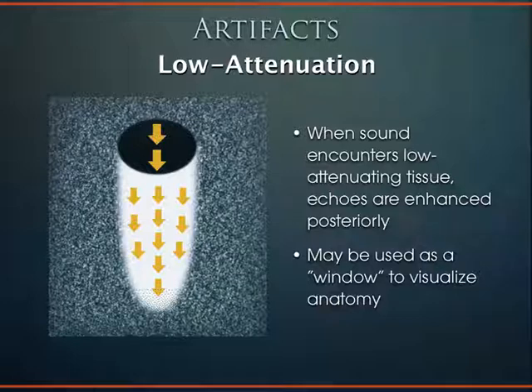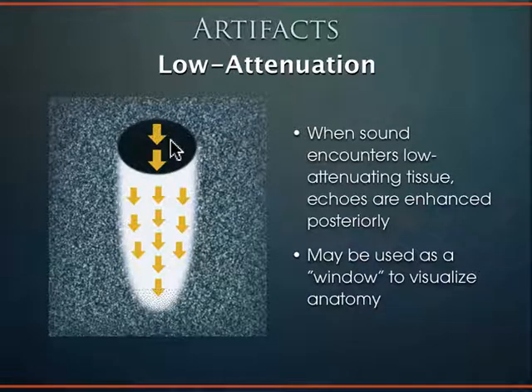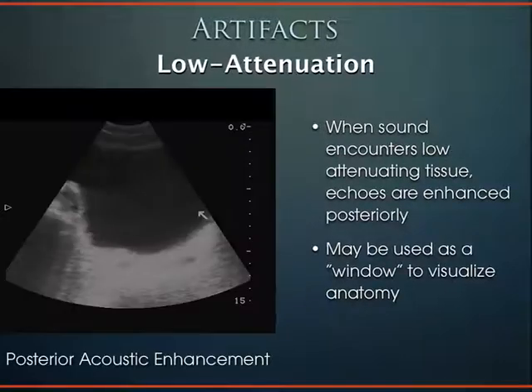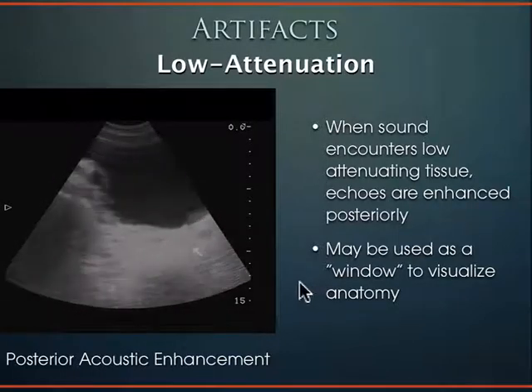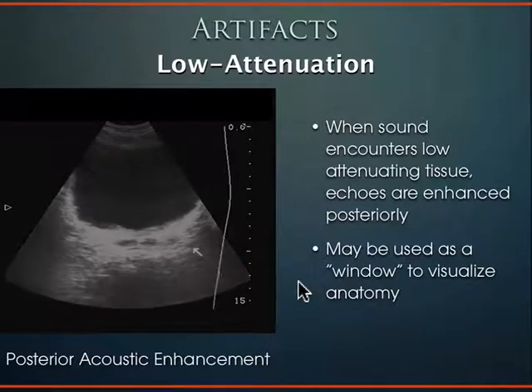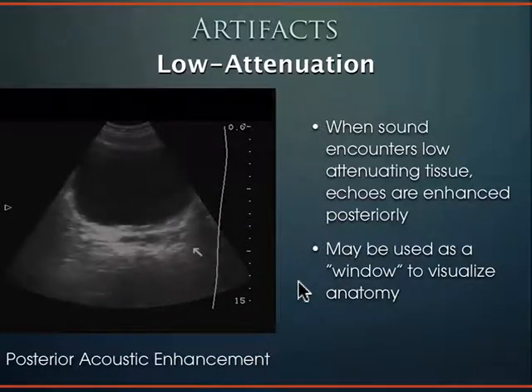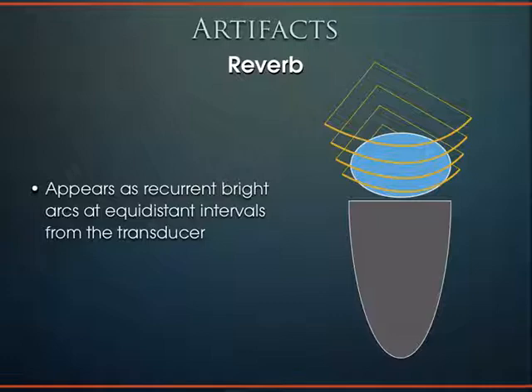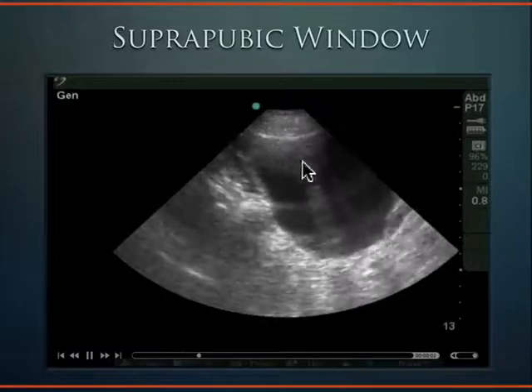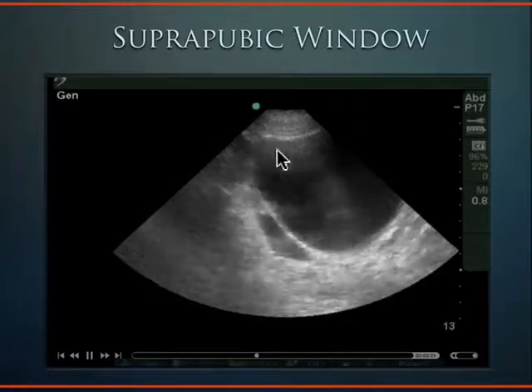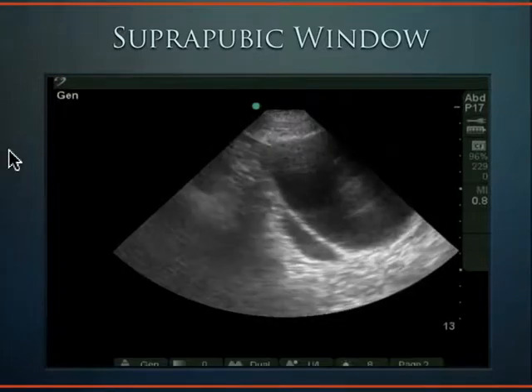Regarding artifacts with the bladder: it's a low-attenuating structure, so sound travels through easily and everything behind it becomes hyperechoic. That's useful, but sometimes you need to turn down the far-field gain because things are too over-gained posteriorly. Another common artifact is reverberation artifact — equidistant bright arcs coming down from the transducer — which we see frequently when looking at the bladder.